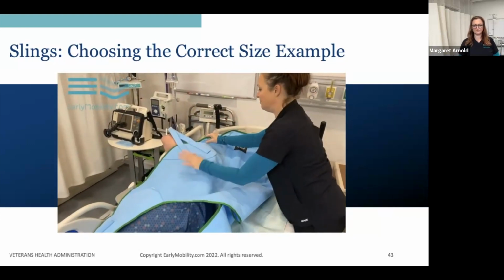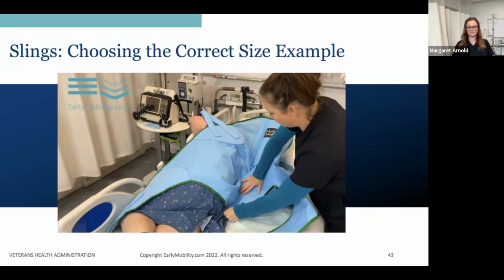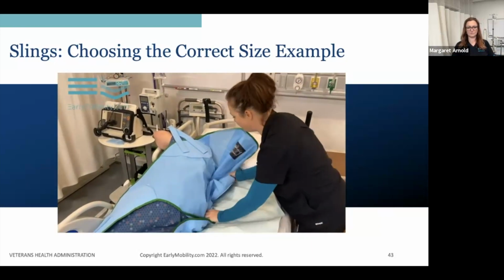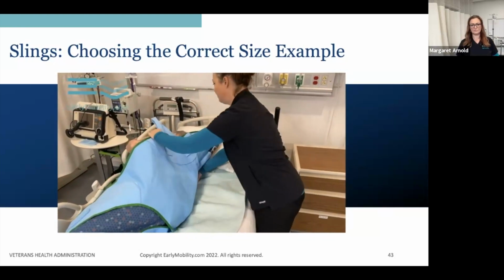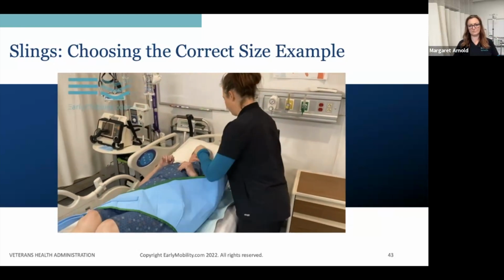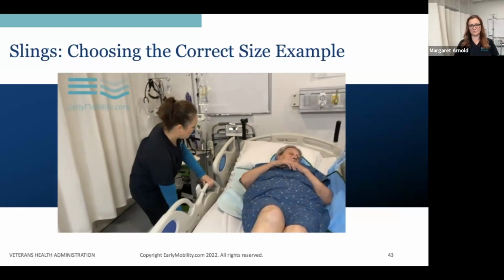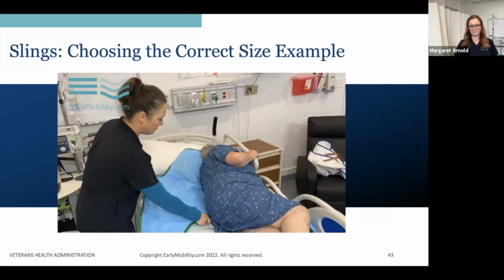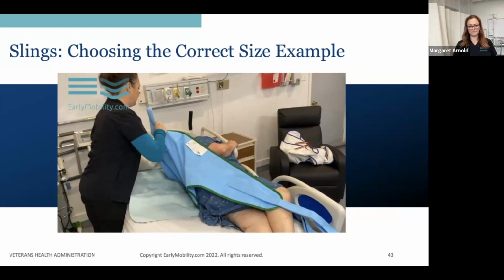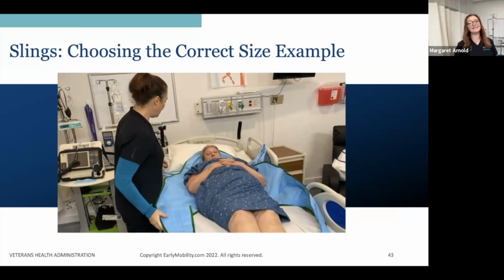So lay this along, put this on her shoulder, and then this comes down to the sacrum, which is the right level. And I'm going to just tuck you here a little bit, then come on back. Yeah, roll back. My wheels up this side, and I'm going to get the rest of the sling from the other side. Roll. Yes, ma'am. Good. And again, it's lined up, so go ahead and come on back, Jack. Sling is in. So that's an example of sling sizing with an incorrect size and also with a correct size of sling.